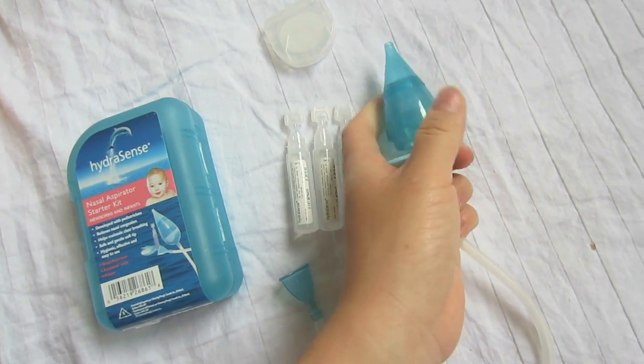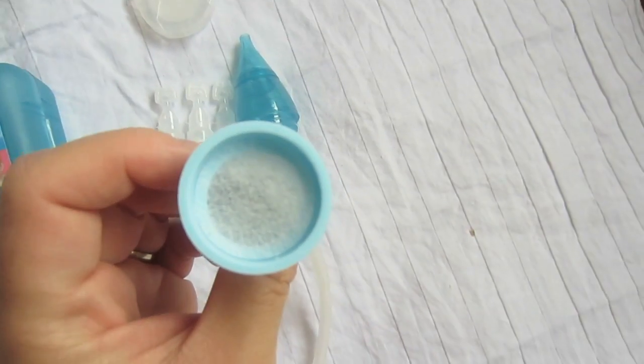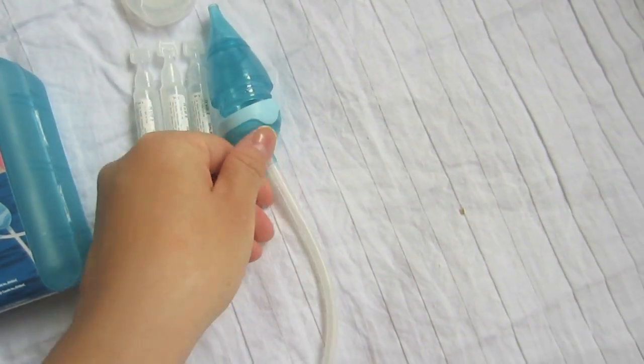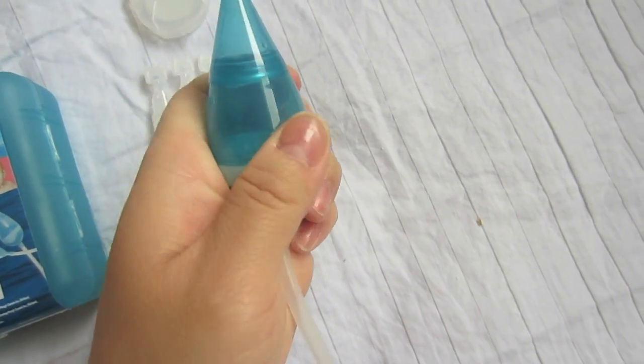Now with the aspirator, the first thing you do is take a filter out and put one in here, then you close it tight like this.